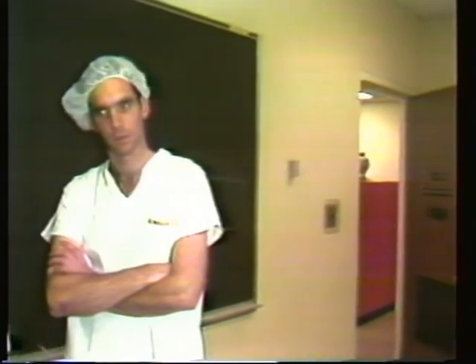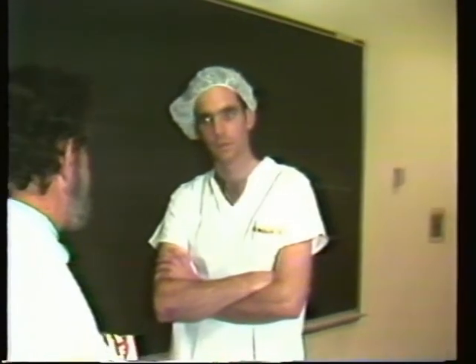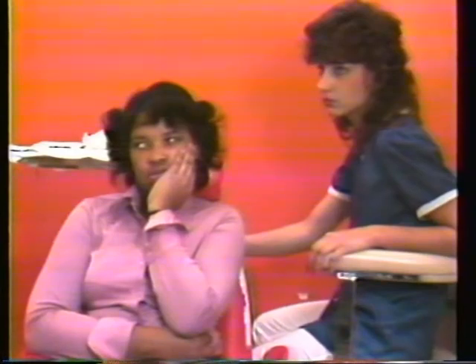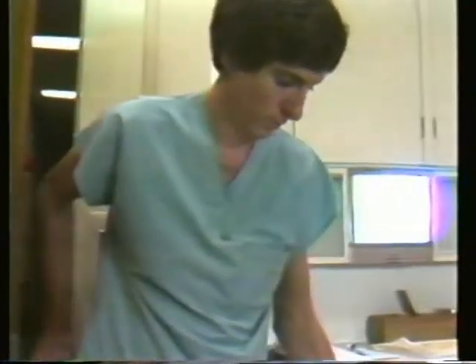Note the student's use of non-technical language rather than the technical language of our profession. By the way, you may not have ever seen the orange pill before, but you can look them up in the identification section of the physician's desk reference. You have not given a diagnosis. Pain is not a diagnosis. It is a subjective symptom. Oh, yes, the number 17 forcep is used for lower molars, not uppers.